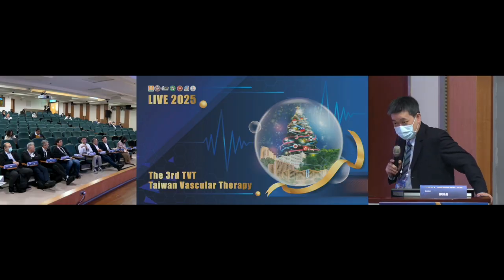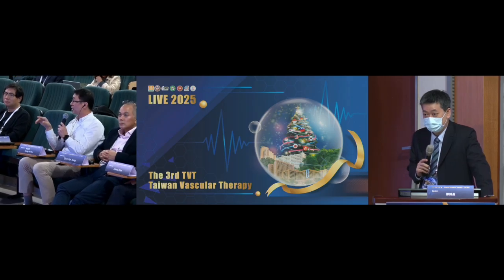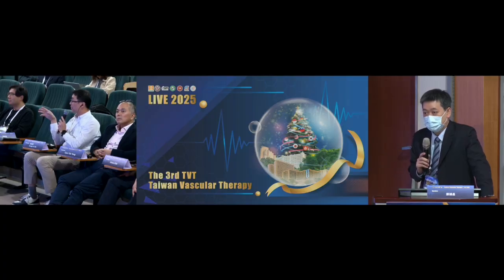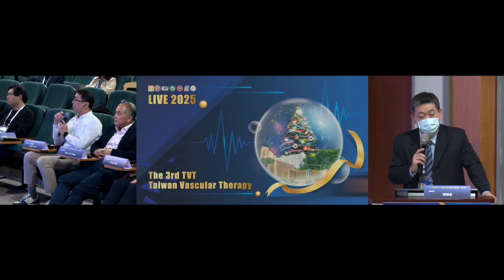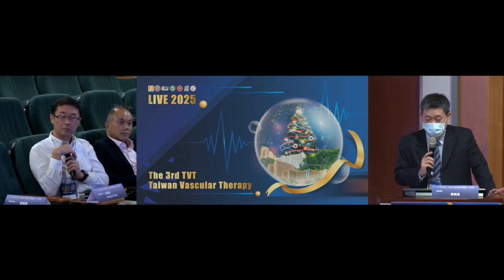I am a radiologist. How about the CT rules in CTEPH before the intervention? The CT. Okay. I will review the CT scan very carefully.